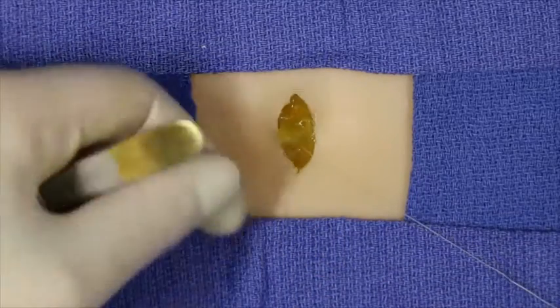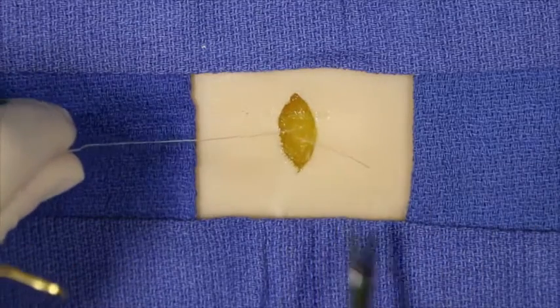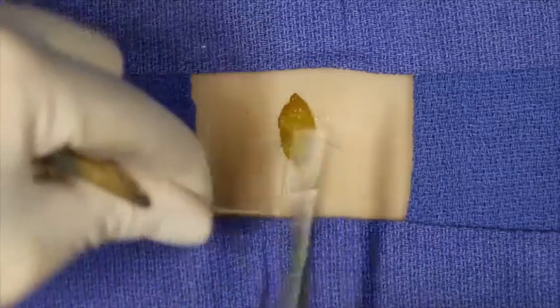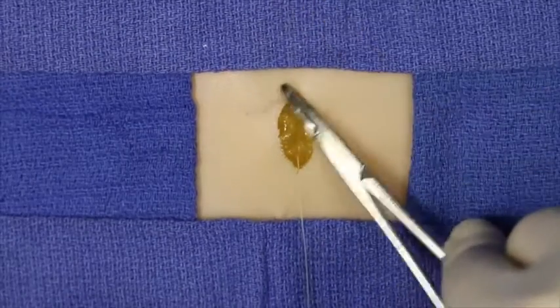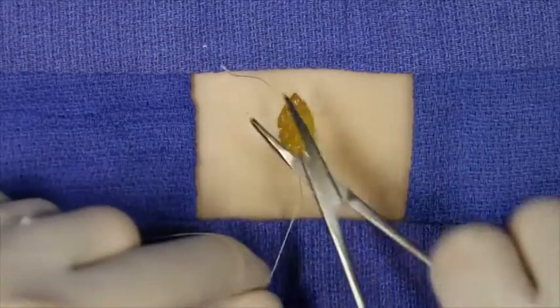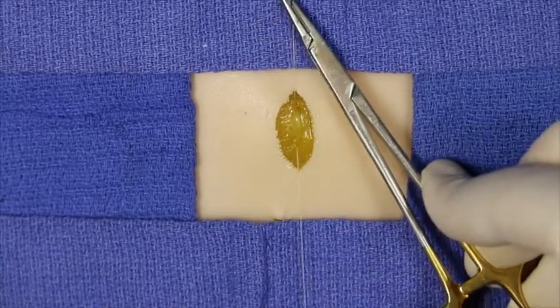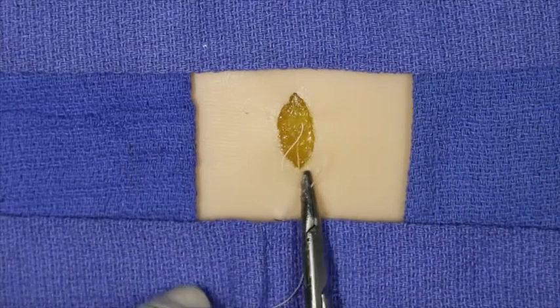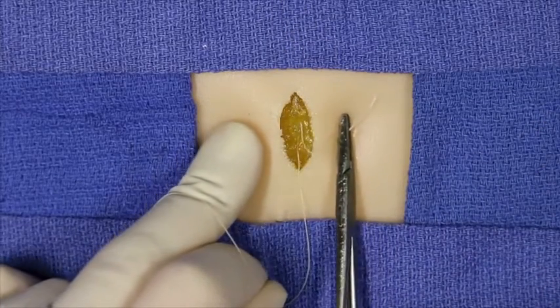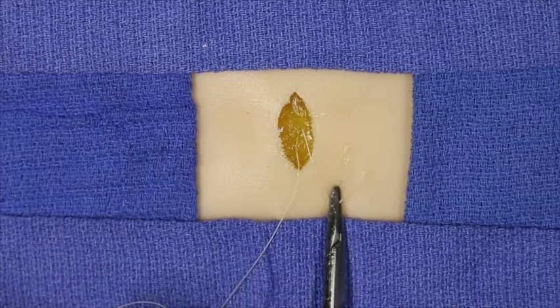This is generally performed in a blind fashion except in times where a large degree of undermining has been performed. The net result of this is to form an exaggerated ellipse as the underlying fascia is pulled together, thus pulling the wound edges together as well.